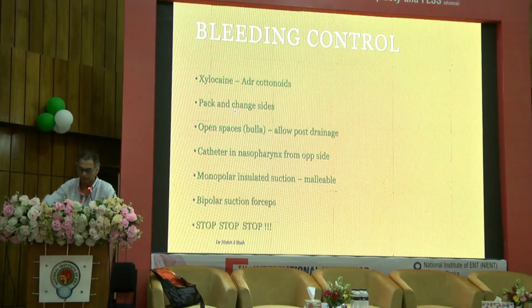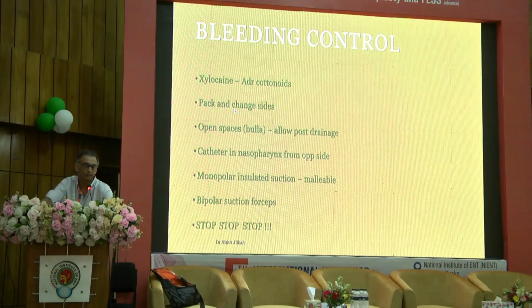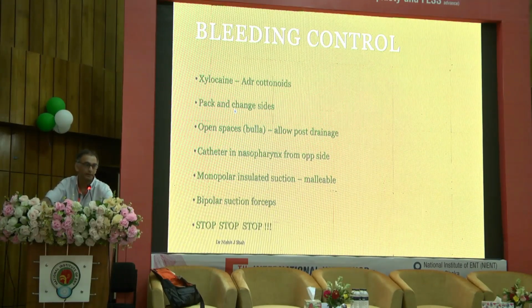You can use monopolar insulated suctions anywhere in the nose except on the skull base. On the skull base, always bipolar. Okay? At any time, if you can't see clearly, surgery must stop. By far, the commonest reason for any complication is lack of vision because of bleeding. So if you have bleeding in your field, arrest the bleeding. If you can't, pack the nose, get out, come back another day.